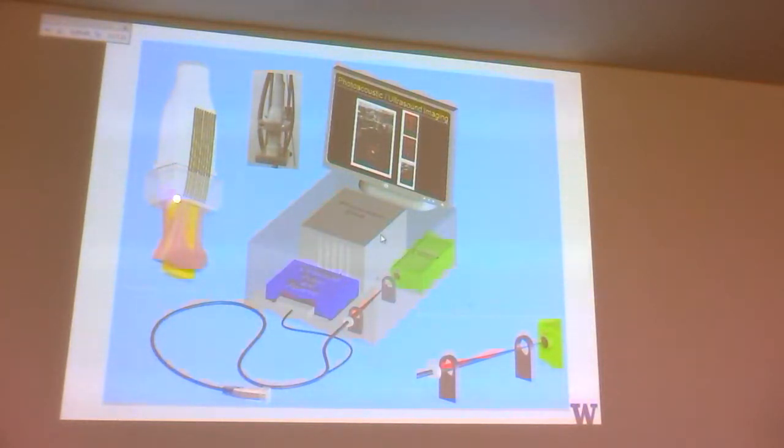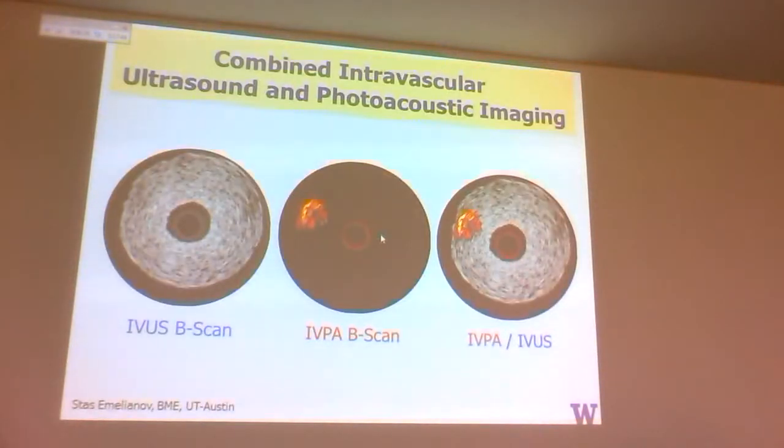You illuminate, and you try to make a cross-sectional image, so you try to optimize the light delivery to a region. Again, you're not doing volumetric imaging. The light is diffusing, so you're losing efficiency with depth. But this was the first level of trying to do a trade-off in these studies, and these were the type of systems of about 10 to 15 years ago.